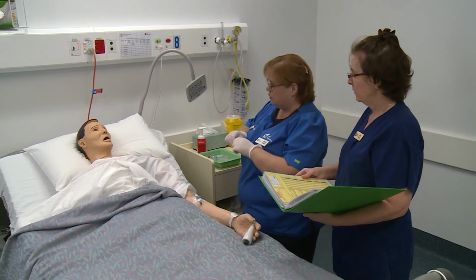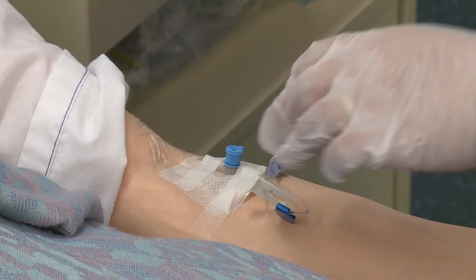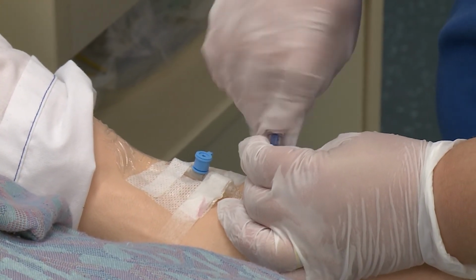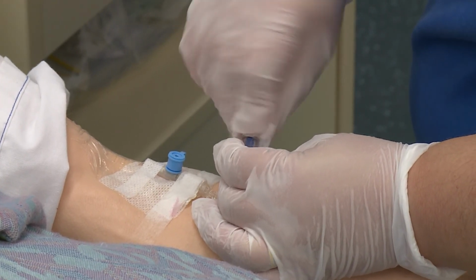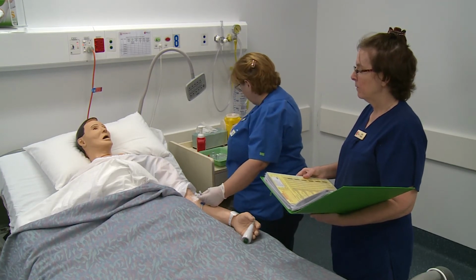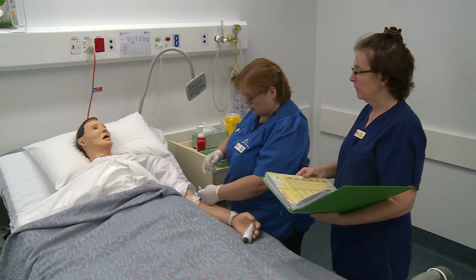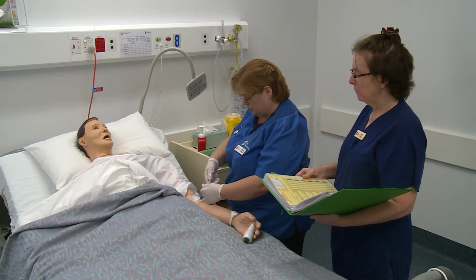Okay, Thomas, so what I'm going to do is start off by cleaning your cannula hub. I'm going to clean it for 10 seconds. Okay, and I'm going to hold that and let that dry for about 30 seconds. While I'm holding that, making sure it doesn't get contaminated, I'm going to prepare my pre-flush.